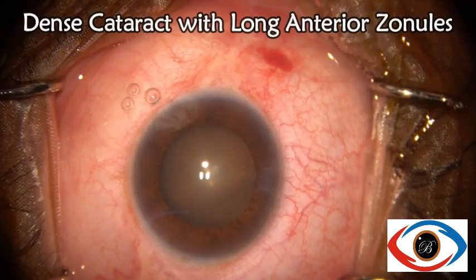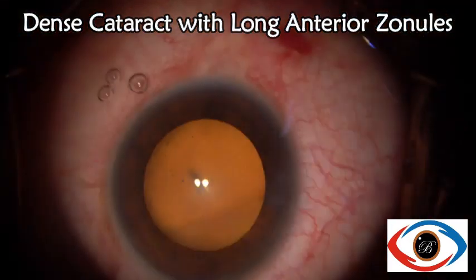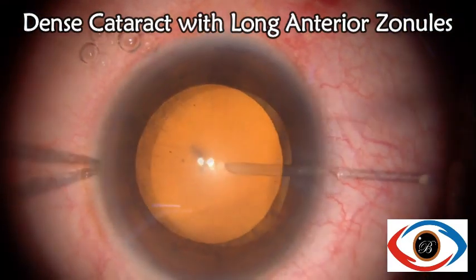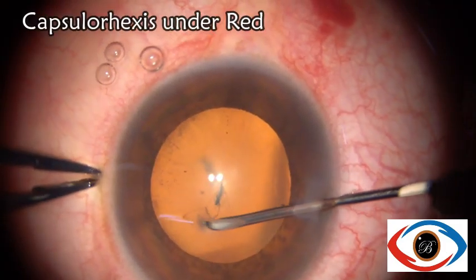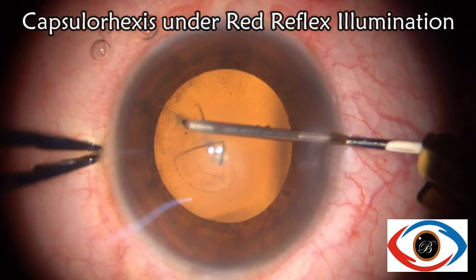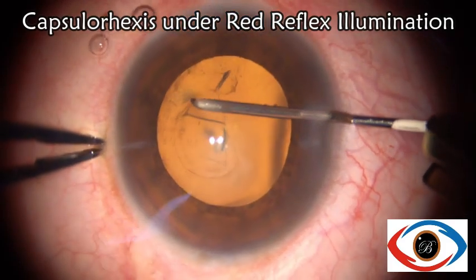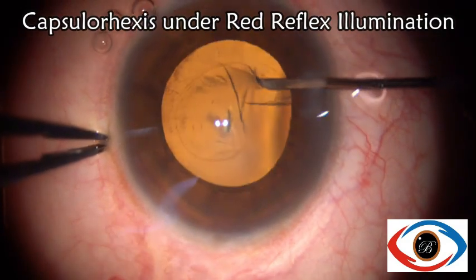The third case is that of a dense cataract with long anterior zonules, or LAZ. These become more prominent as the knob is turned into position 1, and shearing of these long anterior zonules can be appreciated when the rhexis is performed.